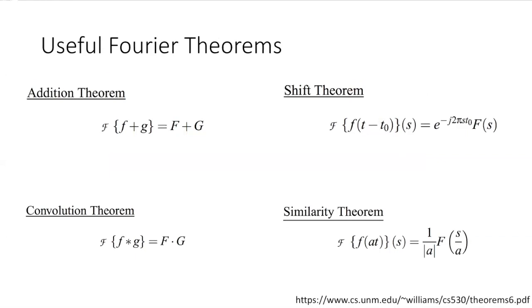And this is unfortunately just a boring slide of some useful Fourier theorems to keep in mind to have a better understanding of what's going on in our final image. In particular, for example, the shift theorem in the top right: if you have a shift in one space, you'll have a linear phase change in your Fourier space.